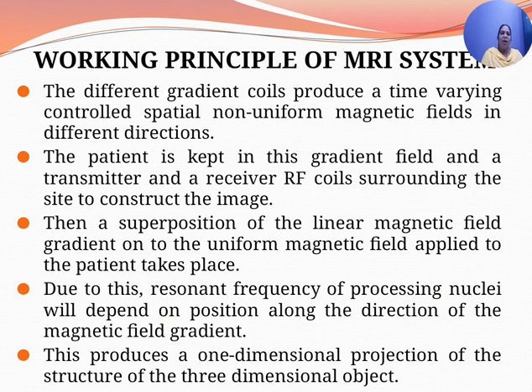Working principle of an MRI system. As we have seen earlier in the figure, the patient is placed in the field of the permanent magnet. So, what is happening here? As I told you earlier, resistive magnets or superconducting magnets are used.